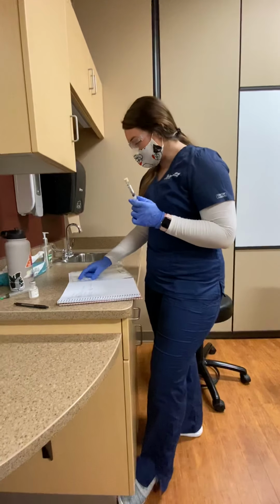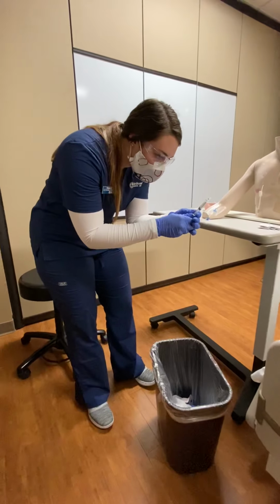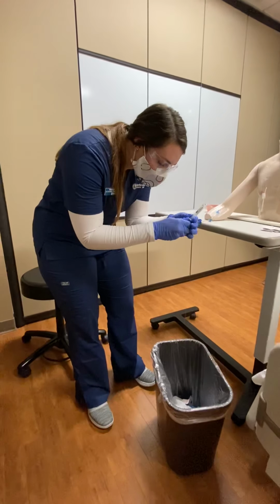So I'm going to get dose accurate without contaminating. Make sure I get out all the bubbles. I'm going to go to 1.6.